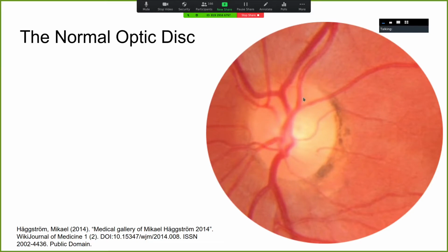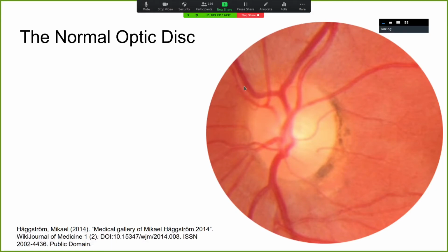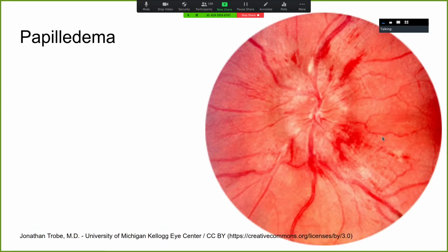So when I instruct my students how to look for the optic disc, I say look for the sun. The sun is your optic disc and you'll see blood vessels on it. If you happen to have an ophthalmoscope at the time, you can look at your household member and just catch the red-orange reflex first, and then if you find a blood vessel, follow it. If you follow it and it branches further, then it means you're going further away from the optic disc. But if you follow it and you see it converges with other blood vessels, then you've found the optic disc over here. Some pigments can be seen depending on the degree of the color of the skin of the person you're looking at. Okay, so that's the optic disc.